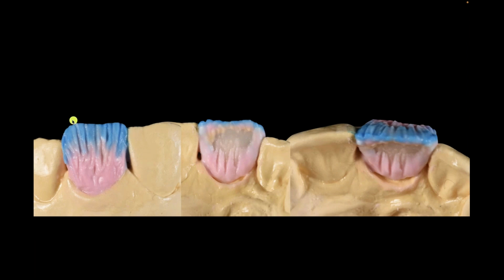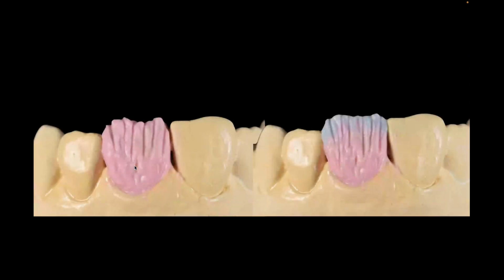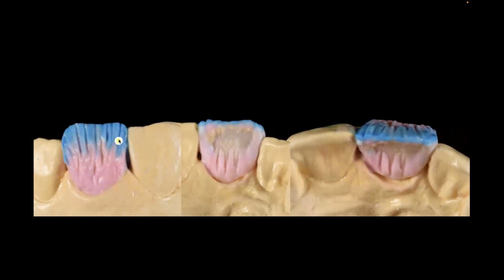But notice as I started to go through more of my enamels and my mamelons, I kind of scared myself when I looked at it here because I thought, oh boy, I didn't put enough translucency on there. But I did. Now look at the second part of this as I'm adding more translucency. Notice that I've come down almost halfway through the tooth, and that allows me to really create that canvas.